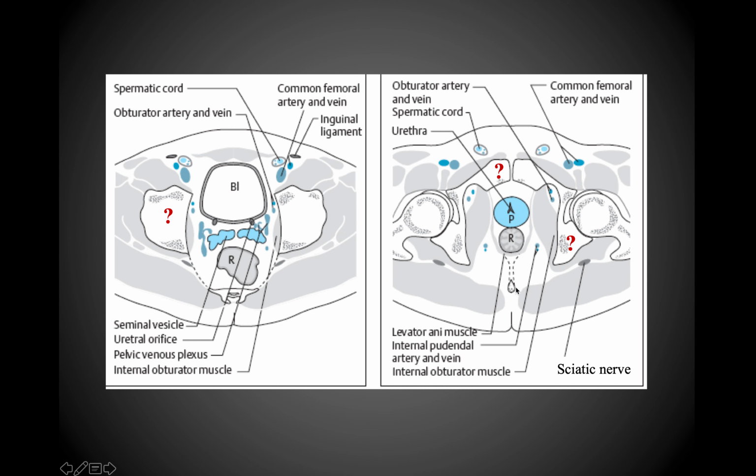You can see part of the coccyx posteriorly, and then just anterior to the rectum, you can see the prostate here. So once you can't see the bladder anymore, usually at that point, that's where you'll see the prostate, because that's sitting just below the bladder, at the base of the bladder. Whereas again, if you can see the bladder, you might be able to see the seminal vesicle, depending on how full or high up in the bladder wall you are.